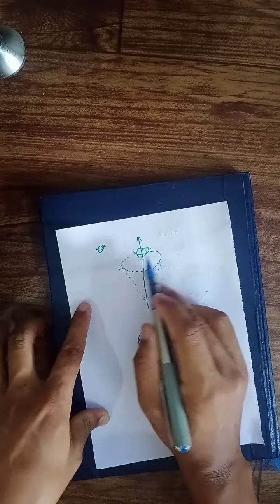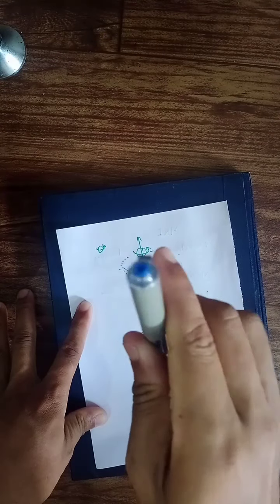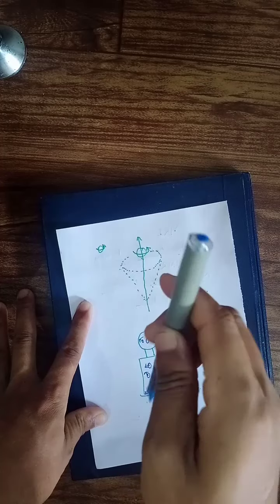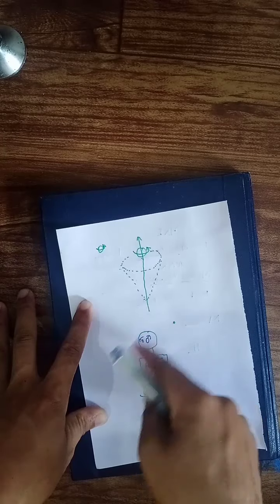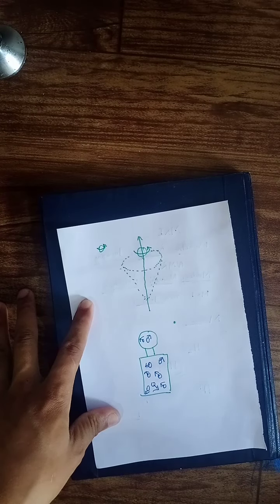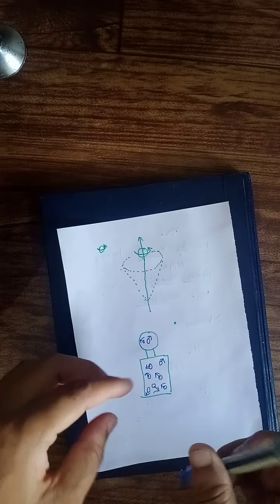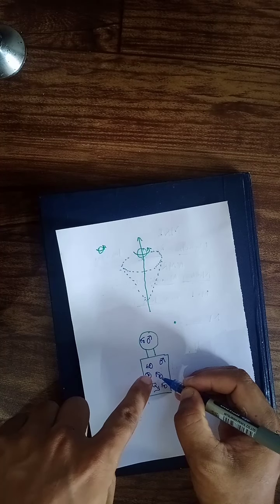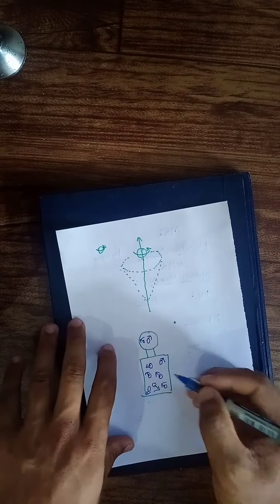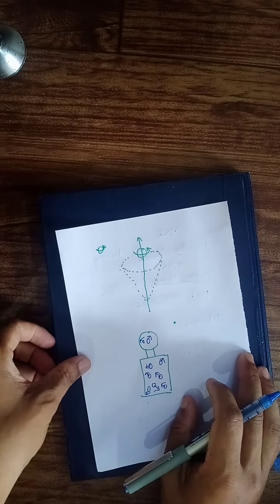So I think your doubt is clear about this, right? A single proton spins as well as precesses. But when you go into the detail of your body structure, inside your body there will be hydrogen protons. These hydrogen protons are spinning as well as precessing inside your body, but in a random motion, when your body is outside the magnetic field. I think till here you got the idea about hydrogen protons, right?